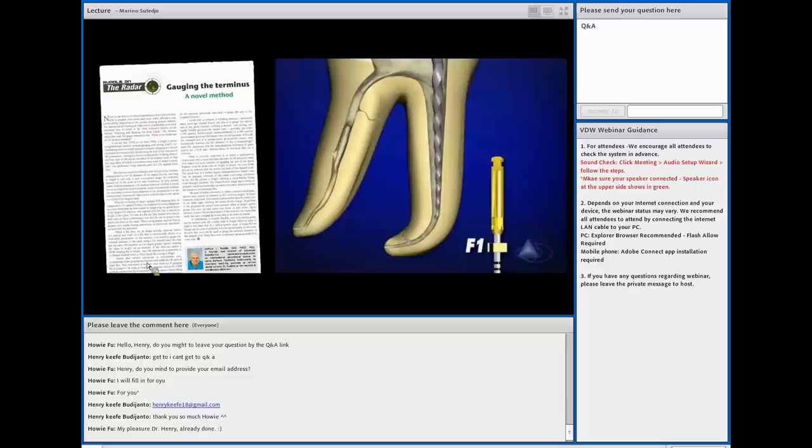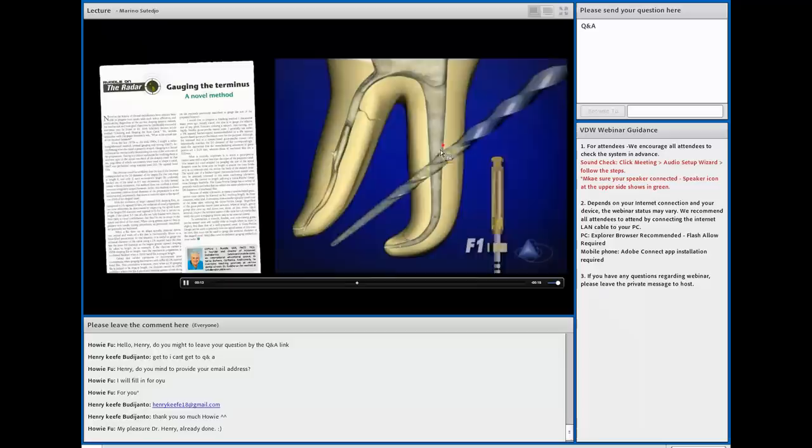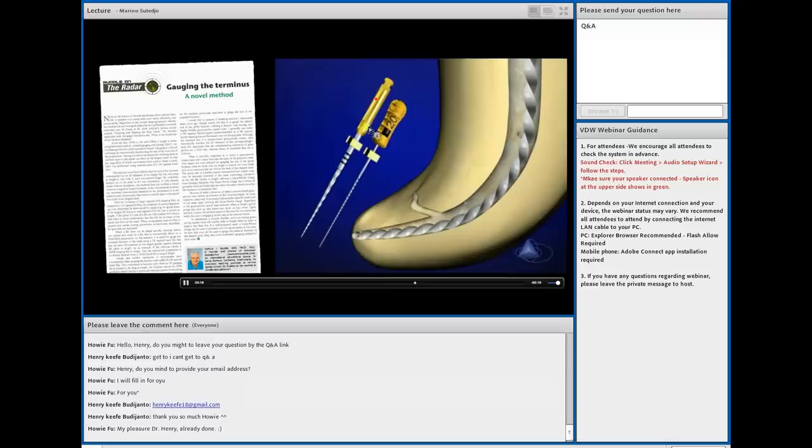It has also been taught by Cliff Ruddle, when he invented ProTaper at the time, he suggested after we finish, you check visually. If you see that the visual is good, it means the debris is touching all over the apical area. It means after you finish with the F1, as the apical is 20, you take a nitinol flex number 20 and check whether it fits or is loose. If it is loose, it means you need to go one size bigger with nitinol flex 25 and make sure it fits. Because sometimes, if you are trying to rotate your instrumentation in a curvature area, it's different from when you rotate it in a straight canal.